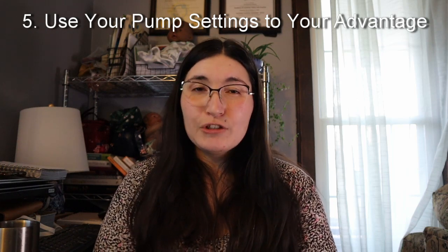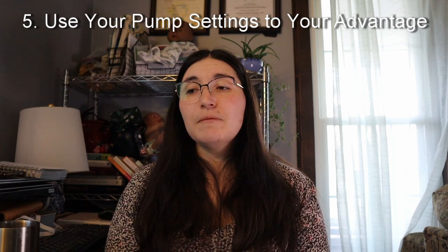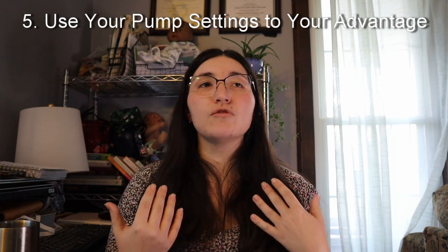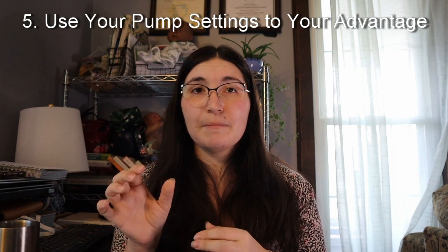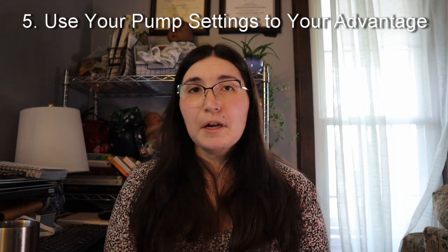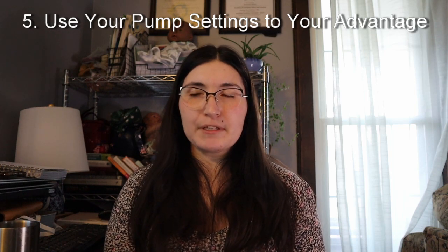Use your pump settings to your advantage. Generally I recommend pumping for at least 2 letdowns. And this can be a little bit tricky if you don't feel your milk letting down. So you really have to pay attention to hearing if the milk is dripping into the bottle, or hearing the milk spraying to the back of the tunnel of the flange. Or just check in, look and see if that milk is dripping and flowing, just to make sure that you aren't inadvertently wasting time during your pump sessions.